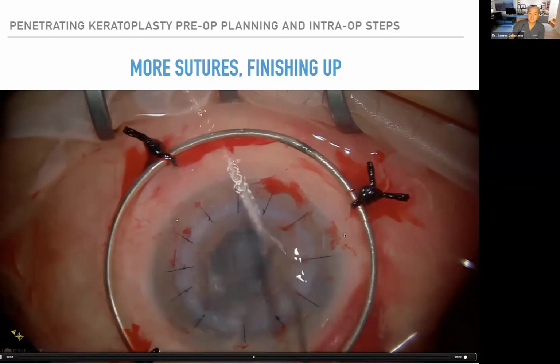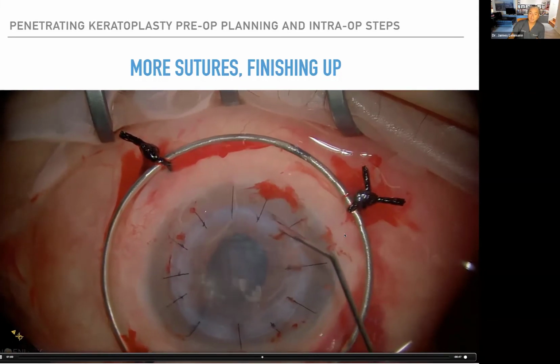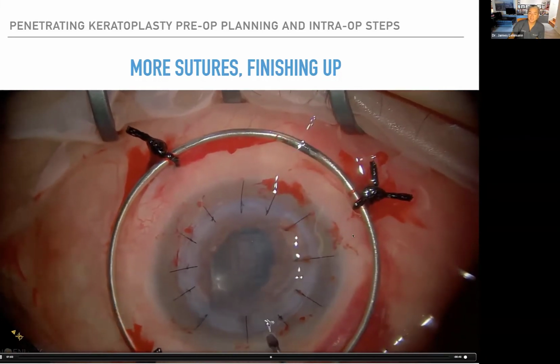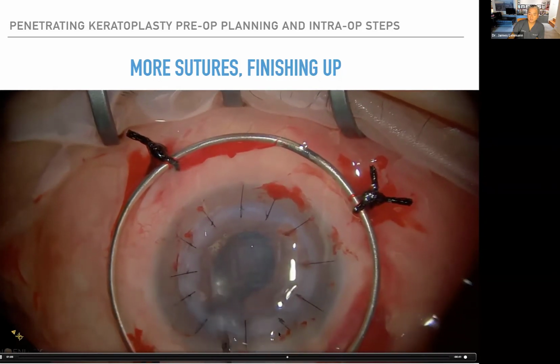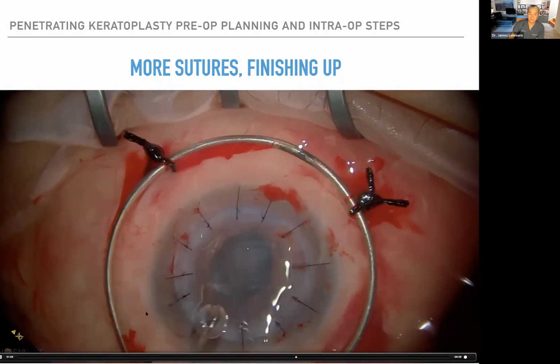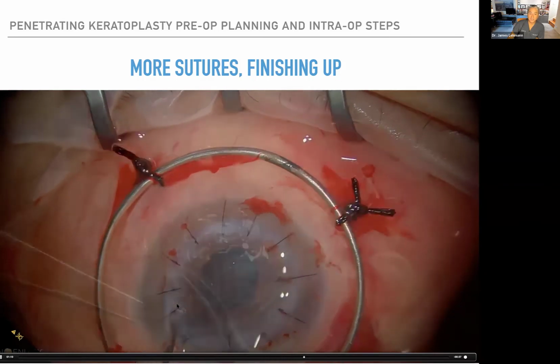Now I'm taking the viscoelastic out, okay? So I'm injecting fluid at the interface all the way around, and you'll see a little expulsion of the viscoelastic when I do that. That's critical because you can't leave viscoelastic.